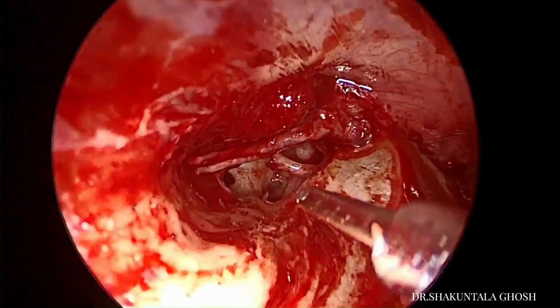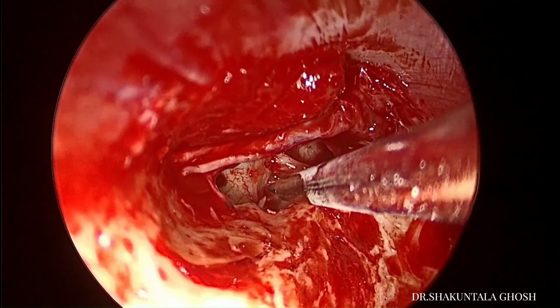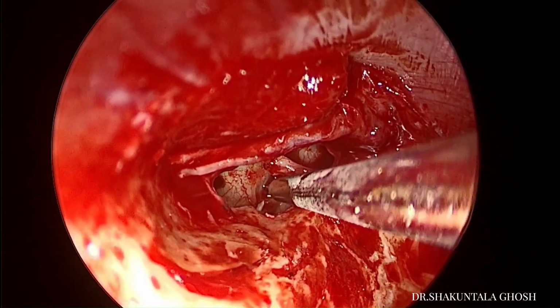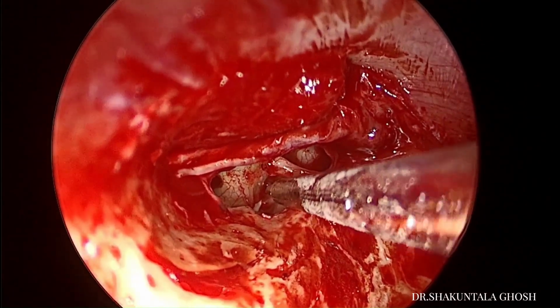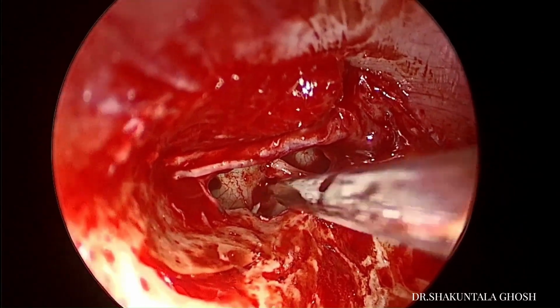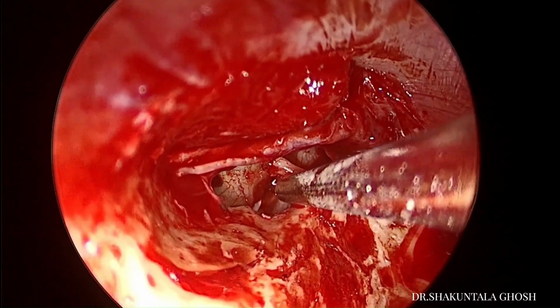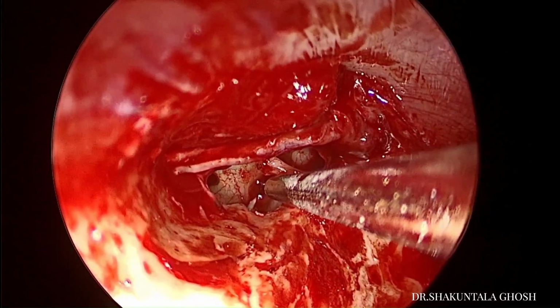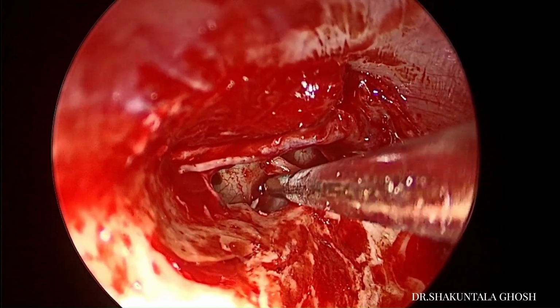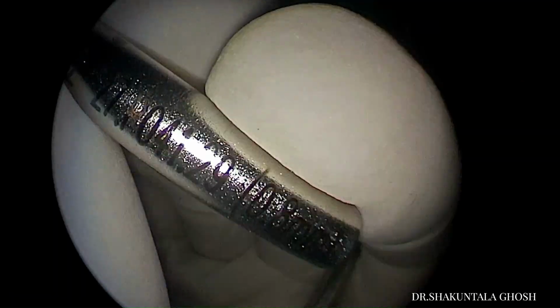Next I take the 0.6 mm diameter pick and try to widen the fenestrum in the foot plate. Very gently one must do that to prevent any subluxation of the foot plate or mobilization of the foot plate or fracture. Luckily this is a thin biscuit focus, so I could make the fenestrum very easily. I am just widening it. You can see the perilymph coming out.